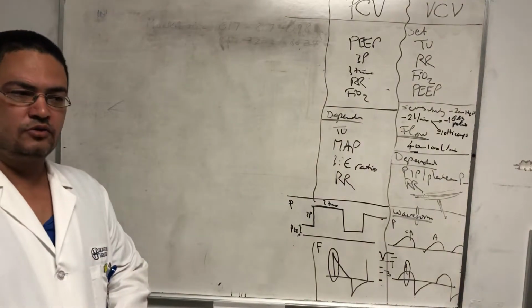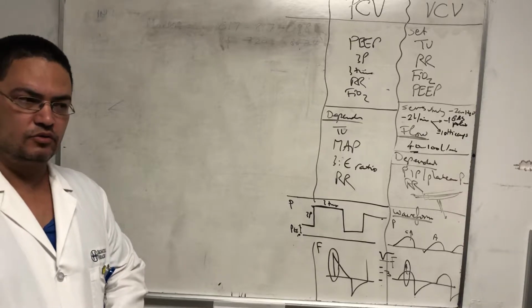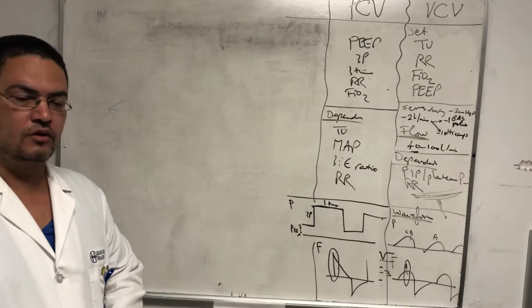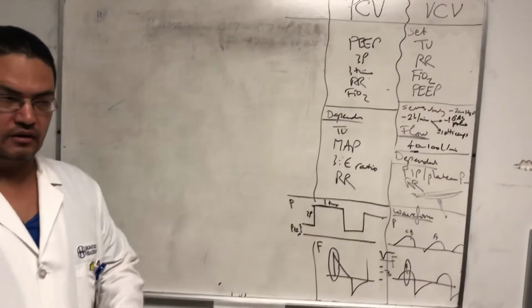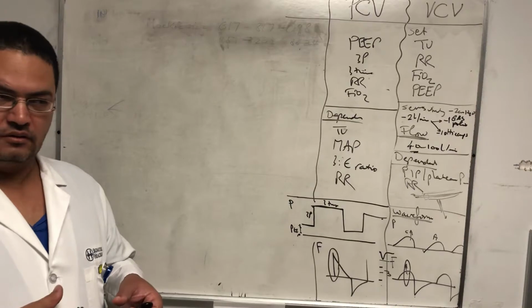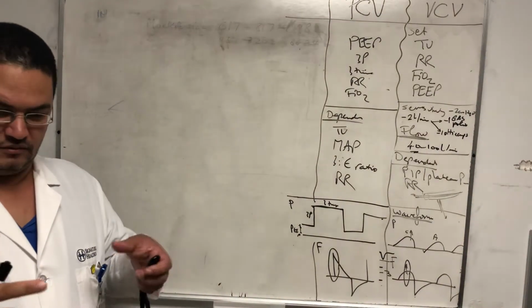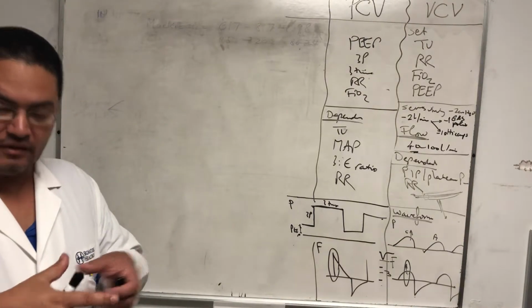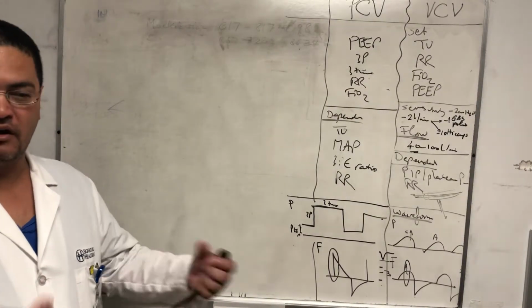When you compare oxygen to CO2, we have a lot of implications. Basically, CO2, as I said, is very fastly diffusible. So when you ventilate somebody that is having a ventilation problem, like a pH problem, you ventilate like this, normal. When you ventilate somebody that's having an oxygenation problem with the ambu bag, you ventilate like this and stay there for a little bit and let go. So basically you're increasing the I time, keeping the oxygen in, allowing the oxygen to diffuse.